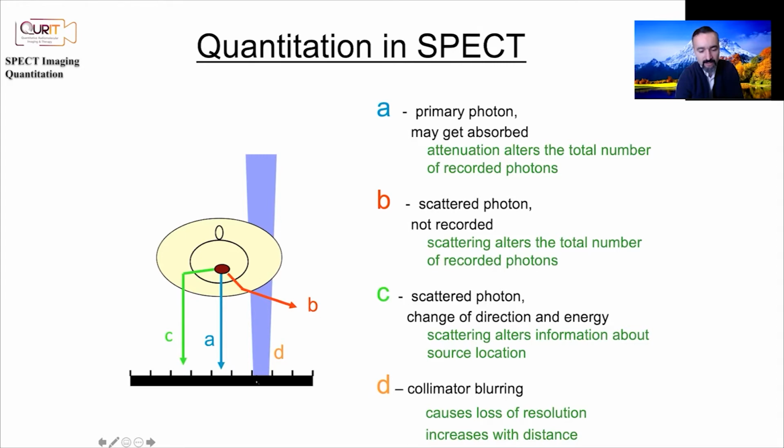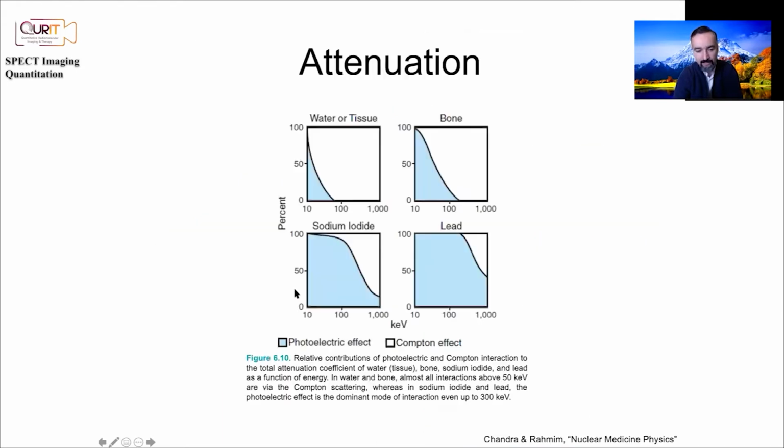all of these could be detected here. Whereas here, a narrower range could be detected here. So basically, because you don't know whether this event that you detected here came from here or here or here, you have some kind of resolution degradation. So you have this distance-dependent resolution problem that you have to tackle, and we're going to have some slides about that.